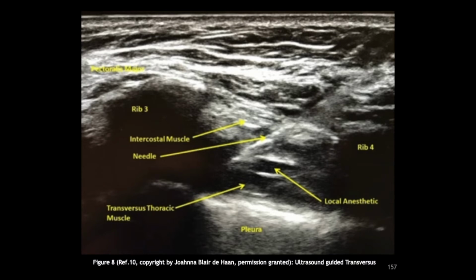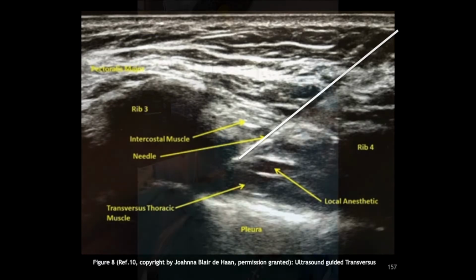Moving the inferior rib off the screen ensures that the needle inserted in an in-plane approach is deep enough to enable the needle tip to reach the plane without bending or being placed beneath the superior rib, where because of the acoustic shadow of the rib, the needle tip cannot be visualized on ultrasound.